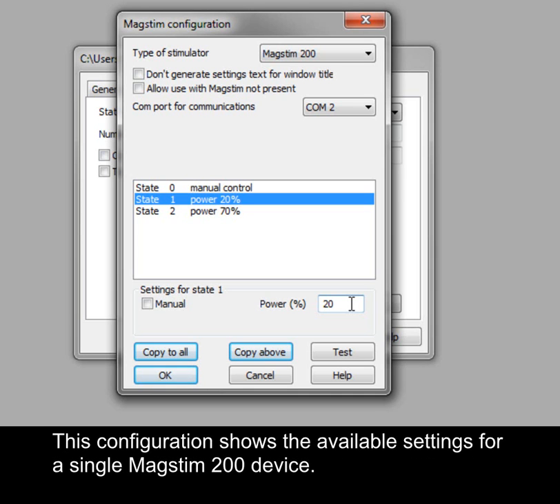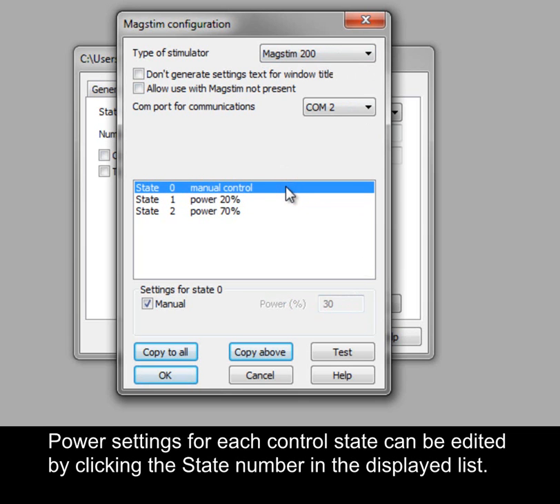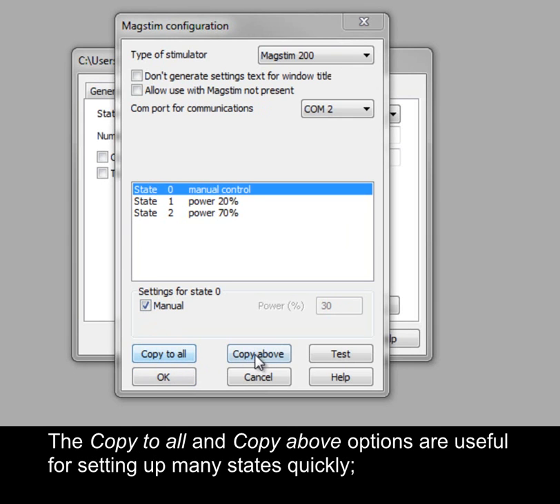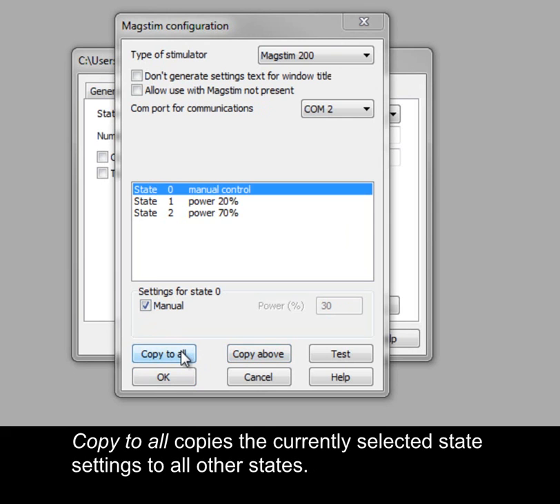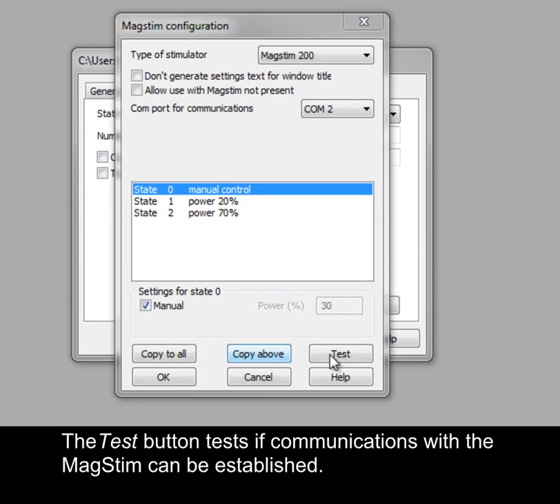This configuration shows the available settings for a single MagStim 200 device. Power settings for each control state can be edited by clicking the state number in the displayed list. State 0 can be set to give manual control of the MagStim device. The Copy to All and Copy Above options are useful for setting up many states quickly. Copy to All copies the currently selected state settings to all other states, while Copy Above copies the current state's settings to all higher state numbers. The Test button tests if communications with the MagStim can be established.